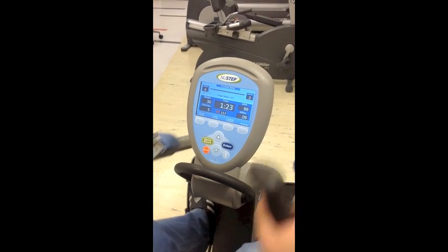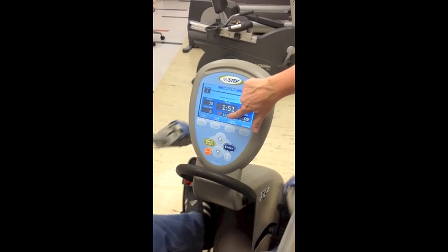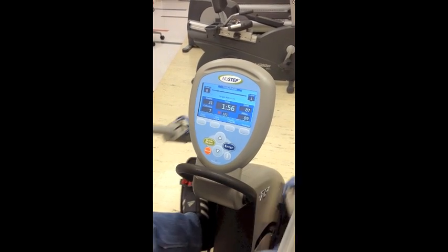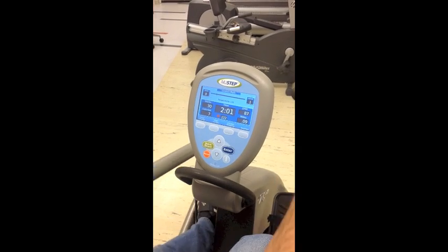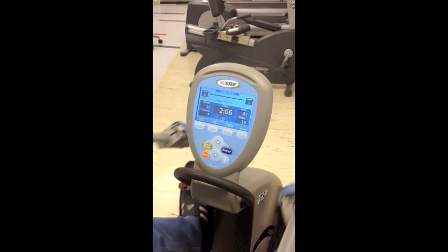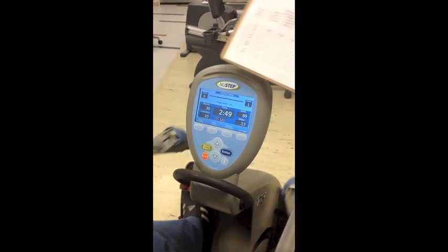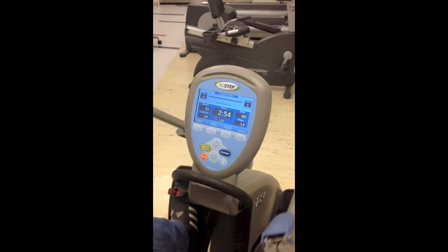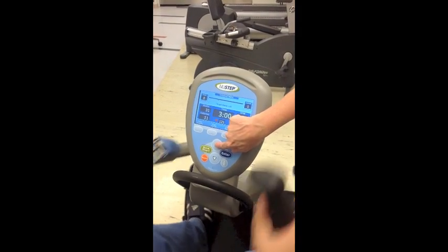At about 15 seconds before the end of this minute, we are going to start watching the heart rate and then record that right around two minutes. Once again, a little before the end of this first stage, we want to look at the heart rate and make sure that it is within five beats. If it is, they get to advance to the next stage.